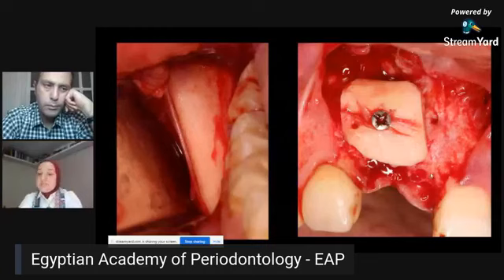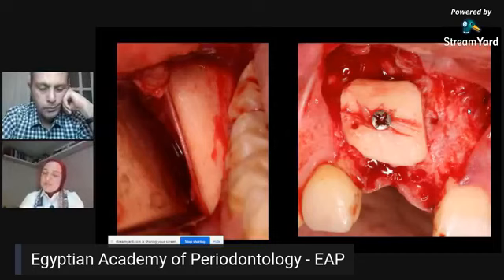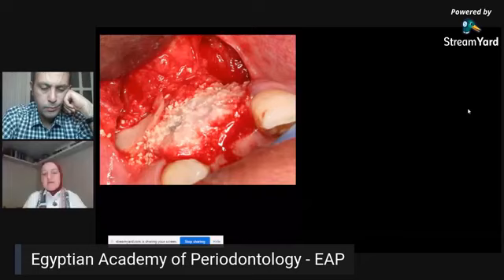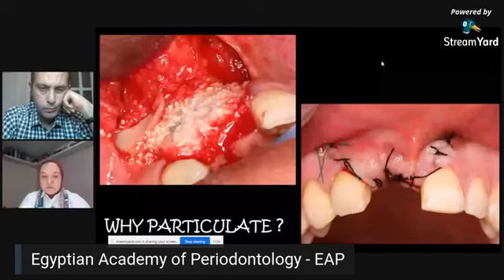I've seen blocks fracture with some friends. So you really don't like to have that, especially since you obtain the block after a huge amount of work. So to preserve your block, you have to make the drill hole a little bit wider to avoid fracture of the plate. And this may answer the question of the block and titanium mesh. Here we put the block and then, to avoid the rapid resorption of the block, we protected it with some xenograft material overlying and, of course, to give some contouring too. And this is the flap closure.